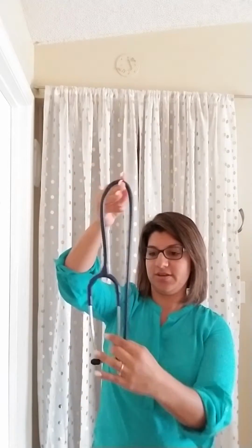So a lot of times in doctor shows, or Grey's Anatomy is one of my favorite shows, you see these doctors walking around with these stethoscopes. Nurses have them as well. The stethoscope is one of the hallmark types of tools that they use. It's very classic. So this right here, you can actually see where you can flip it to turn it on, and that turns it off right there.